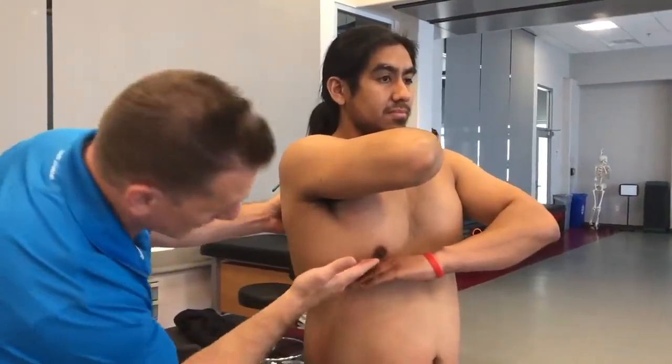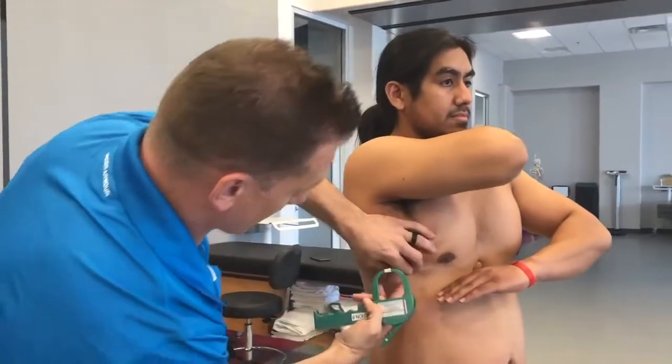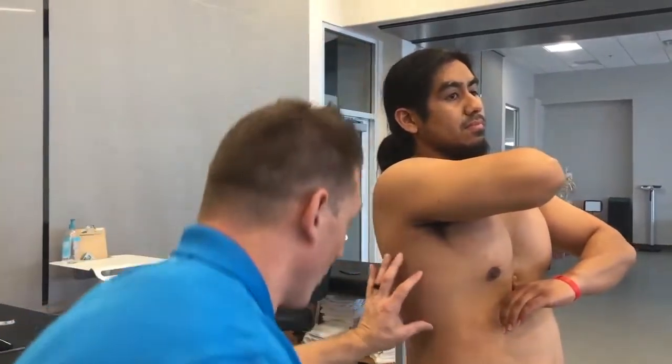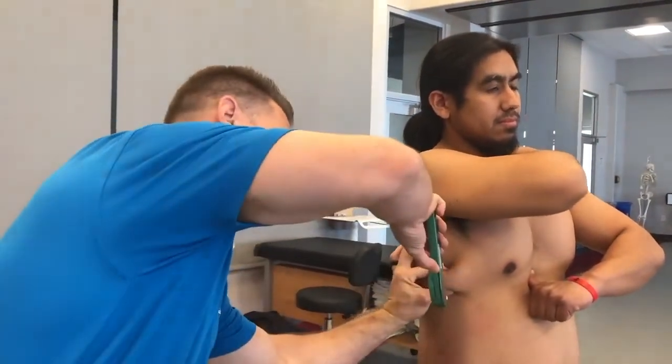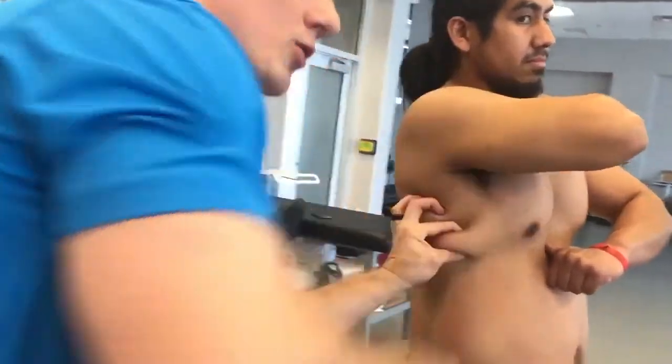Look across and take your pinch. You have an option here: you can take a vertical pinch or a horizontal pinch. For me, I get more tissue with a horizontal pinch on this individual, so I'm going to take a horizontal pinch. It's important that you record which type of pinch you take — if you take a horizontal, the next time your client comes in you're going to take a horizontal. You're not going to go back and forth.